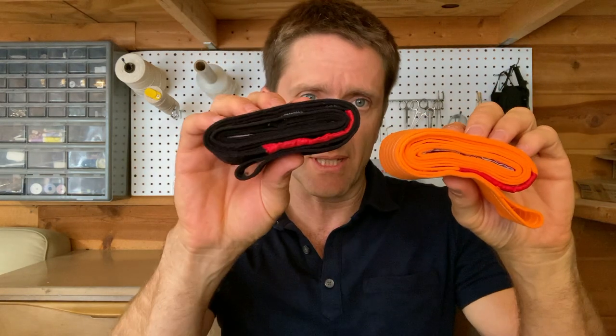Here it is coming out of the case. The case is big enough to hold band-aids or ibuprofen or other items if you like. There is an orange version and a black version, and it's very light — less than 1.2 ounces.